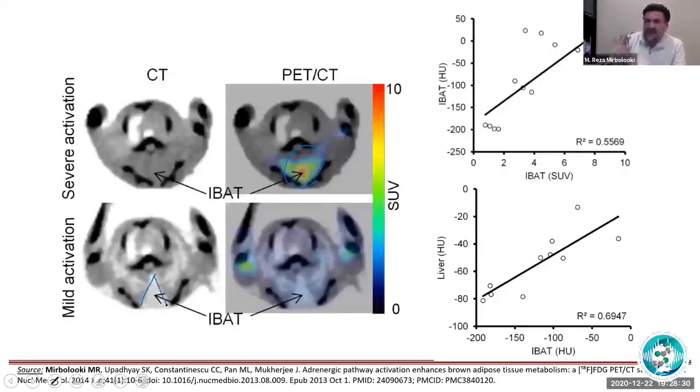So instead of a black background with a white image, you have a darker image with a white background to be able to see the effect. So basically this white area here is not denser, it's darker, than in a real CT that we usually see.